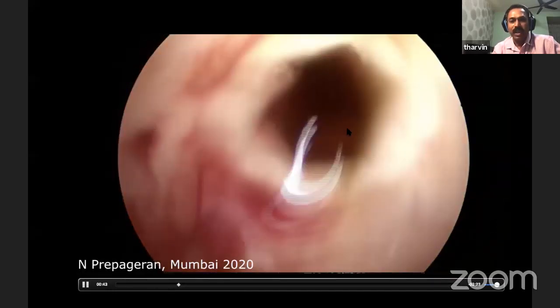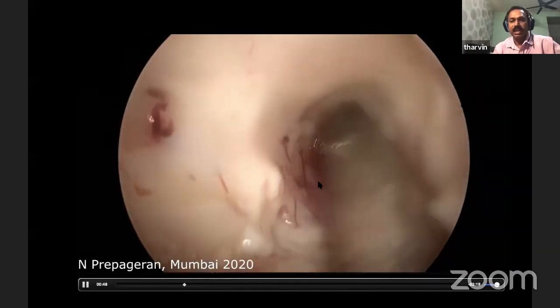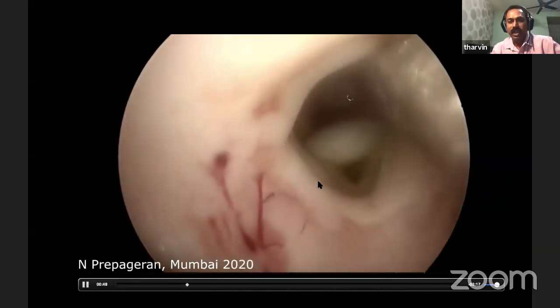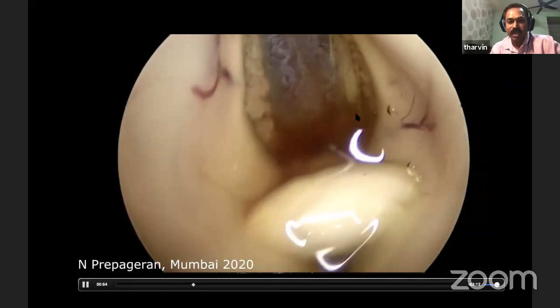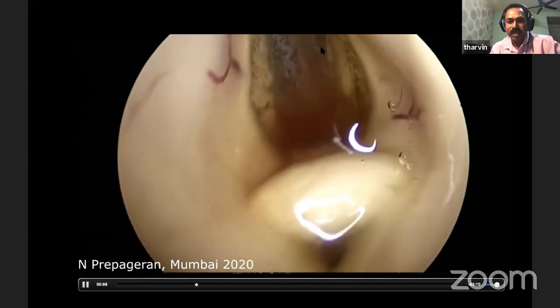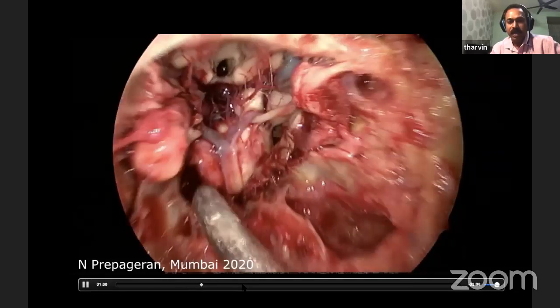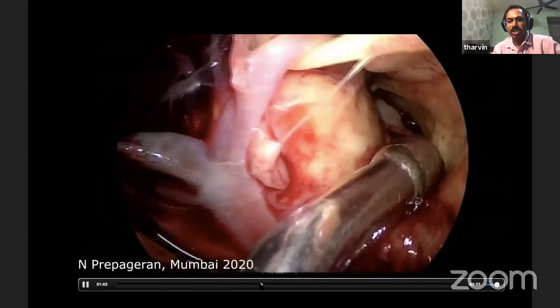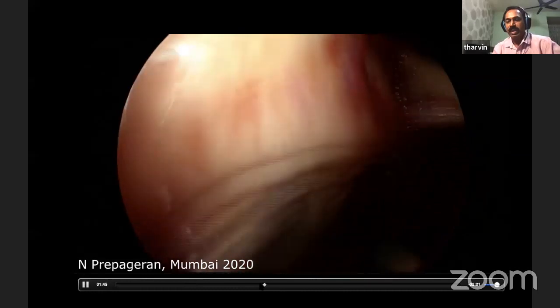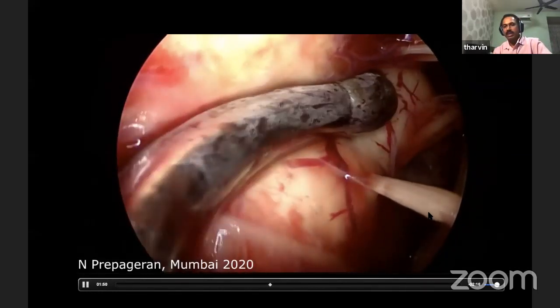And now we are looking at the fourth ventricle. So let me just suction out the CSF from the fourth ventricle. And now we are looking at the choroid plexus region as well in the fourth ventricle. Aqueduct of Sylvius, and that's the choroid plexus from the third ventricle coming downwards with aqueduct of Sylvius. The same way now, if we do a transclival for this patient as well, by using a J suction, we're going to push the brainstem away. And this shows us very nicely the view. That's the 6th cranial nerve, as you can see here, coming into view.